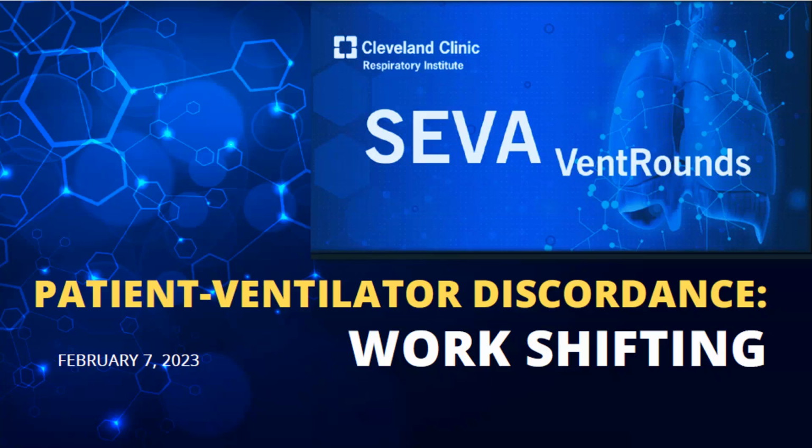Today is February 7th, 2023, and we're going to talk a little bit about patient-ventilator discordance. The topic for today is work shifting, which has gained a little bit more traction in what we should be focusing on. We have some cool cases, some submitted all the way from Missouri, and it will be a nice discussion to be had.